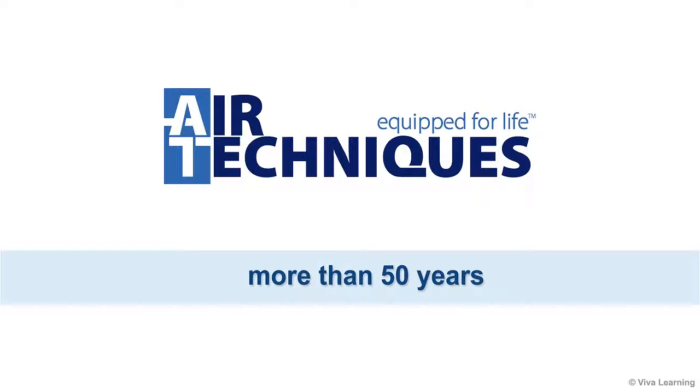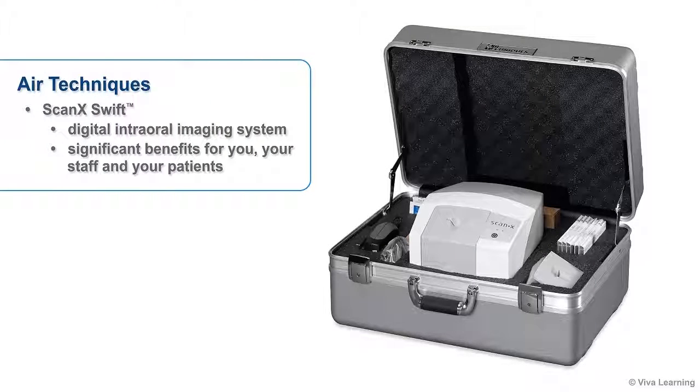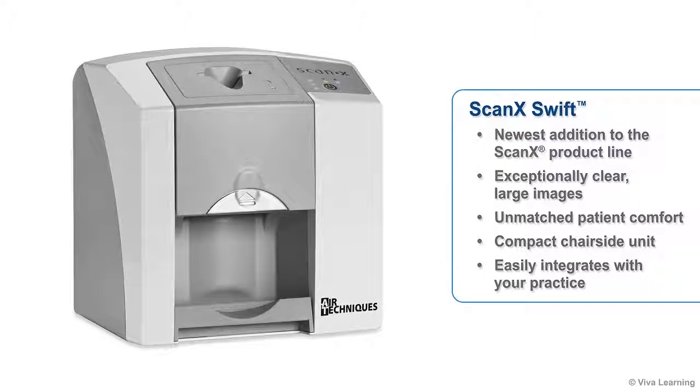For more than 50 years, Air Techniques has been designing and manufacturing state-of-the-art products for the dental industry. Today their commitment to quality and innovation continues with the development of a digital intraoral imaging system that offers significant benefits for you, your staff, and your patients. This video will introduce you to the ScanX Swift, the newest addition to the ScanX product line.